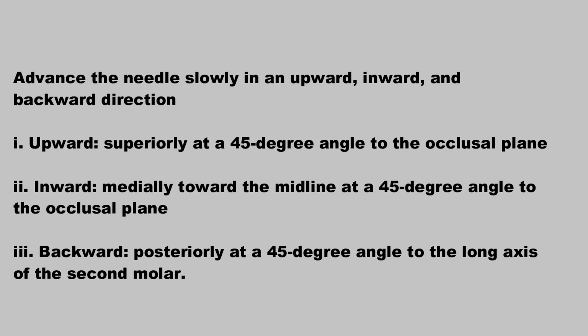Advance the needle slowly in an upward, inward, and backward direction. 1. Upward, superiorly at a 45-degree angle to the occlusal plane. 2. Inward, medially toward the midline at a 45-degree angle to the occlusal plane. 3. Backward, posteriorly at a 45-degree angle to the long axis of the 2nd molar.